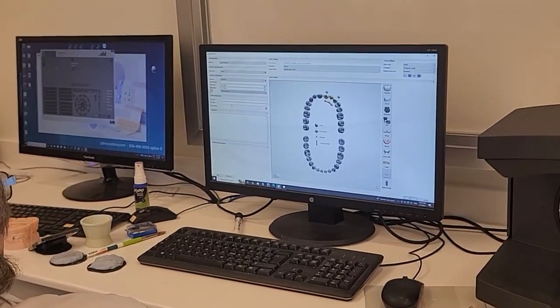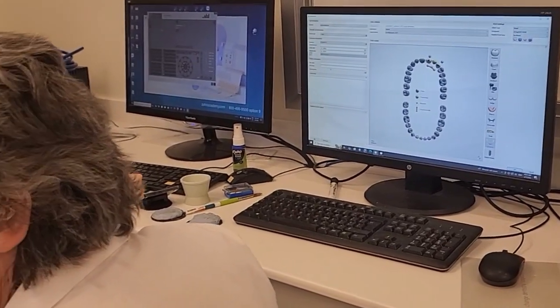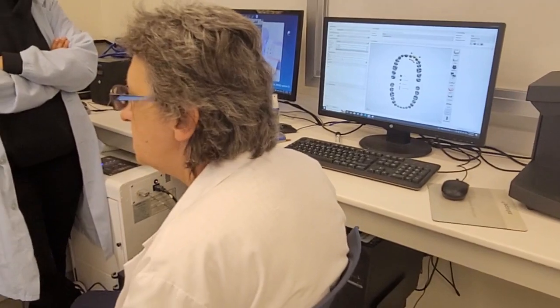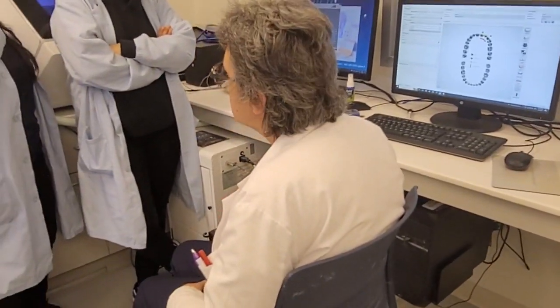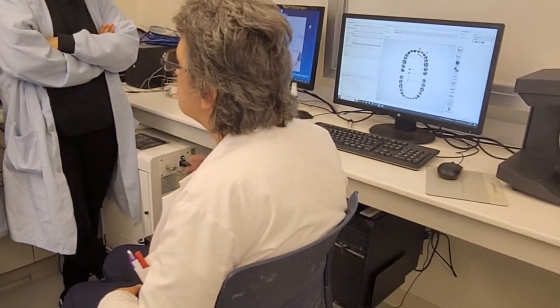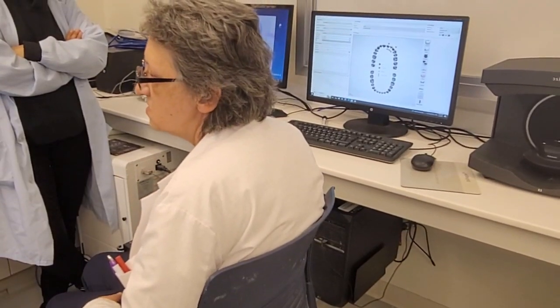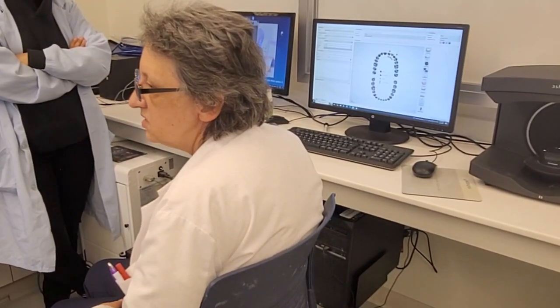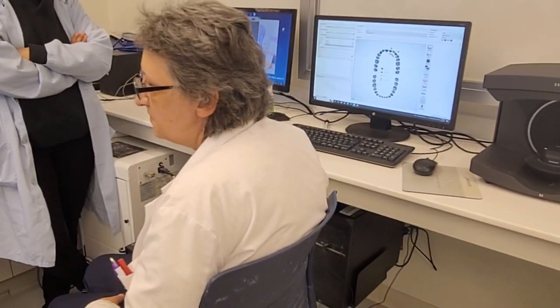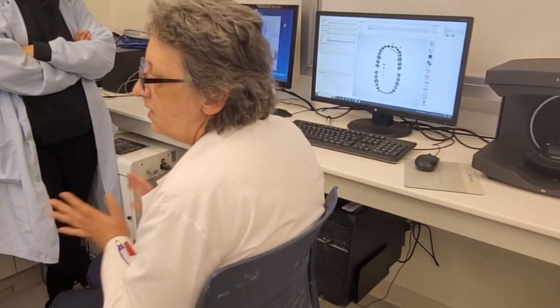Okay. I'm sorry guys, I came out busting this morning and I was like, let me give you a lesson on this, but I think it's important for you to know this. And you know, like I said, you're gonna do this if you do implants routinely, and this is just the beginning. What I show you is just very, very basic. So every technician that does dental implants today should be able to do this basic. Nothing more. So, any questions?